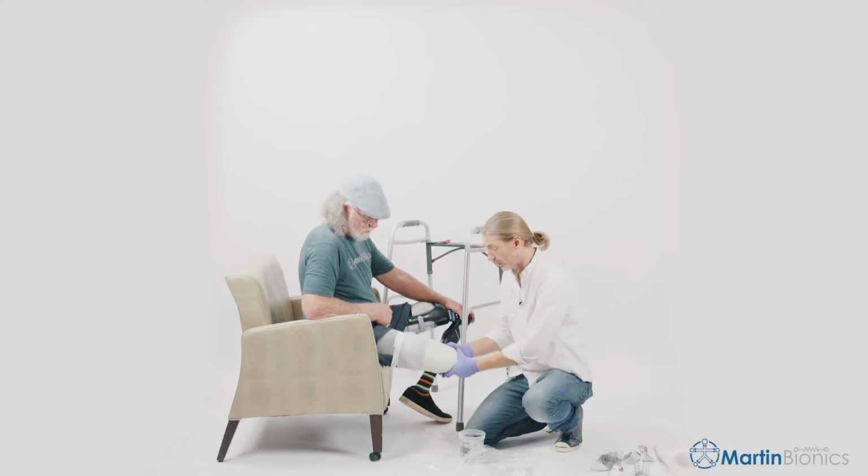We can do this full casting process in sitting or in standing. When we go to the next step, I prefer to do it in standing, but if a patient just is not able to stand for long enough to take a cast, you could do this all in sitting as well.